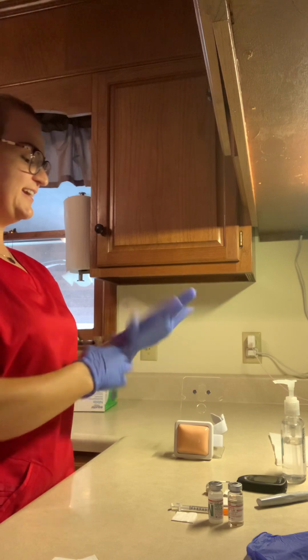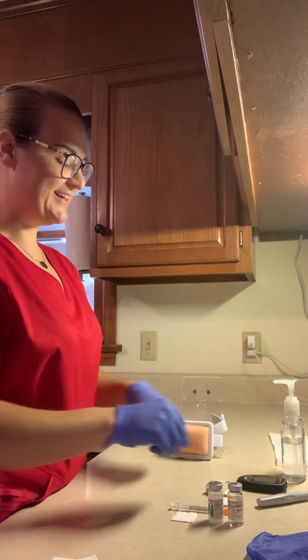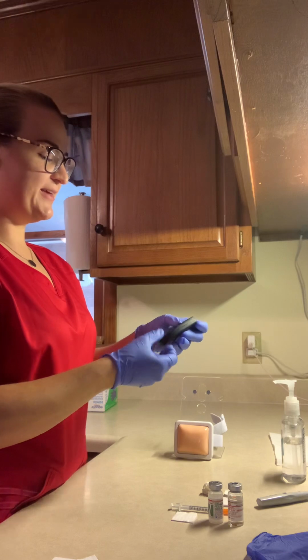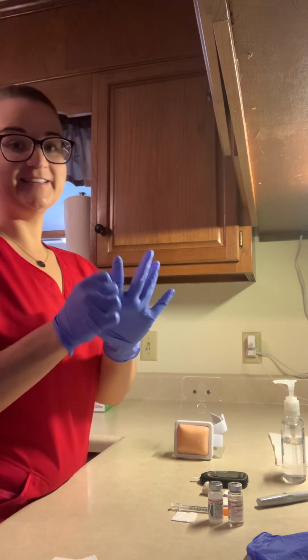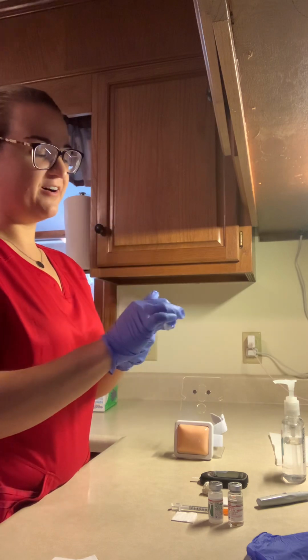And Mr. Johnson, can I help you wash your hands? Okay, great. And at this time, while he's drying his hands, I would put a testing strip in the meter to turn it on. And while it is powering on, I would look at his fingertips using the lateral or distal side of the finger pad and a clean alcohol swab.